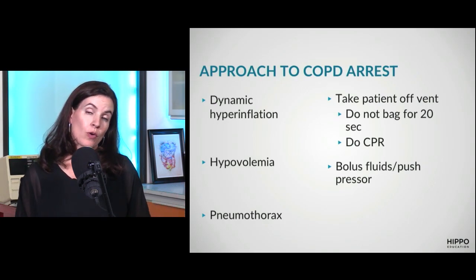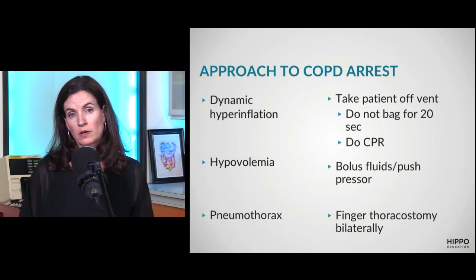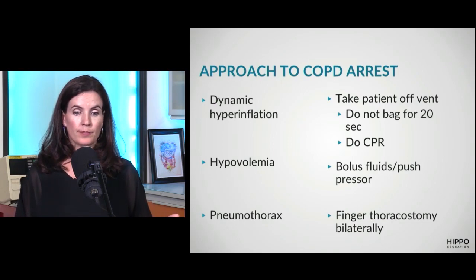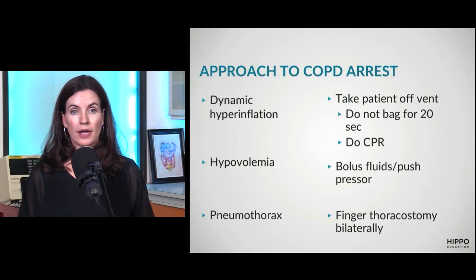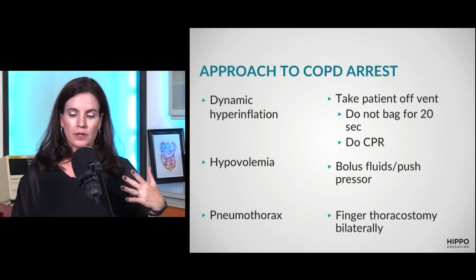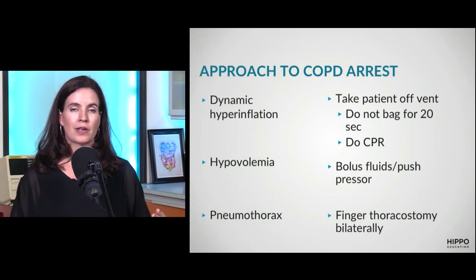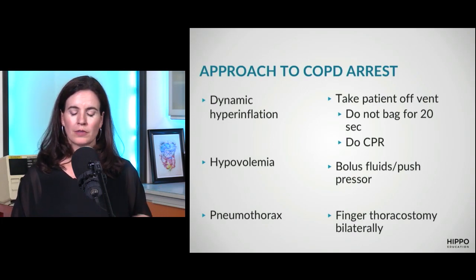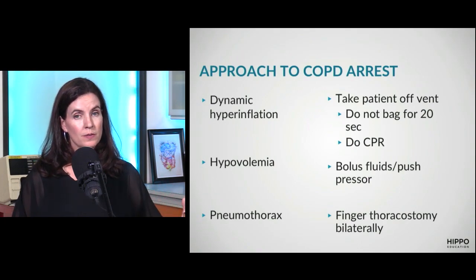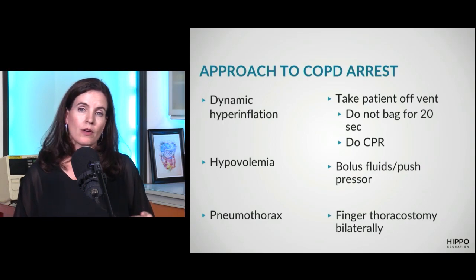And for pneumothorax, my personal approach is that I'll do bilateral finger thoracostomies. We don't tend to do needles at our place because there have been mispositioning of the catheter. And I just would put in a caveat here that in the midst of a cardiac arrest, it is very hard to auscultate for bilateral breath sounds. Somebody's doing CPR, somebody's bagging up top, there's talking in the room, there are alarms going. It can be really hard to hear.